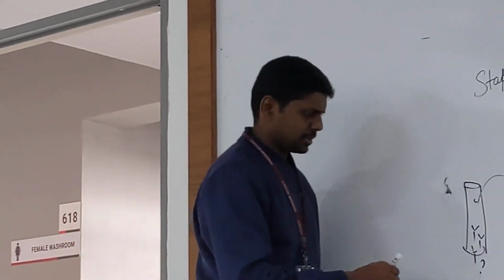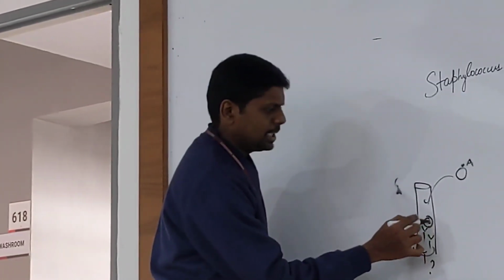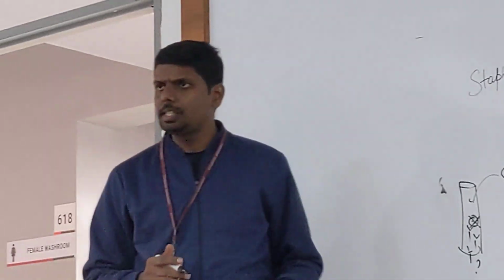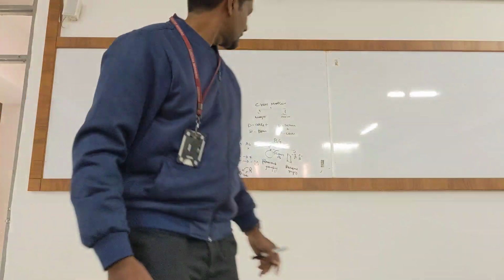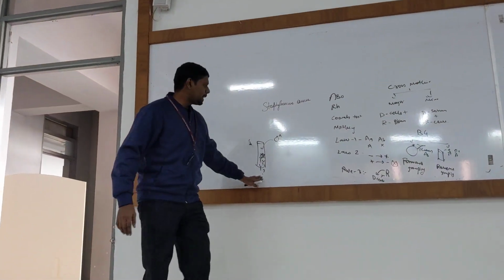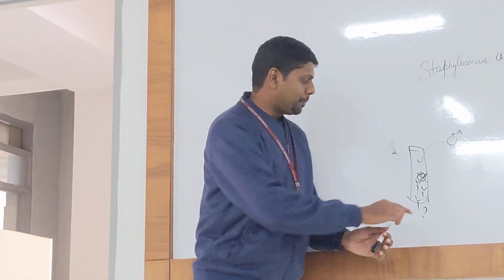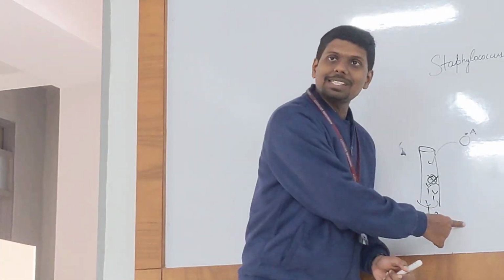Now I got a reaction. The red blood cells are destroyed. What does this indicate? What is the group of this patient? When I added A group cells to my unknown patient, I got a reaction. That indicates my patient has A antibodies.